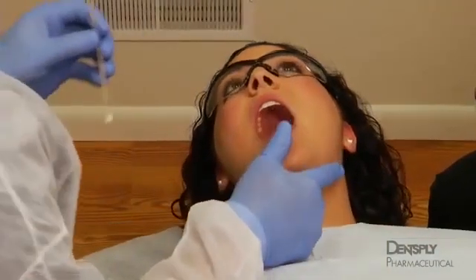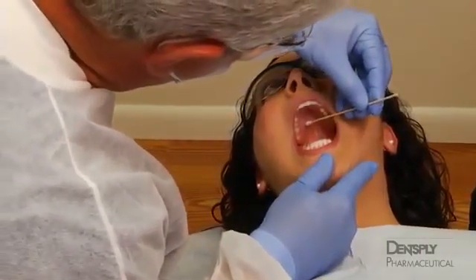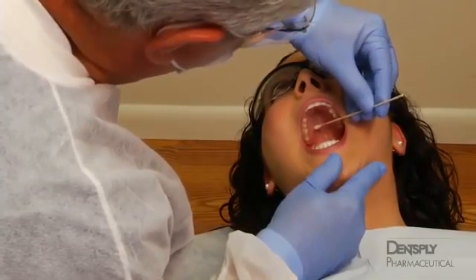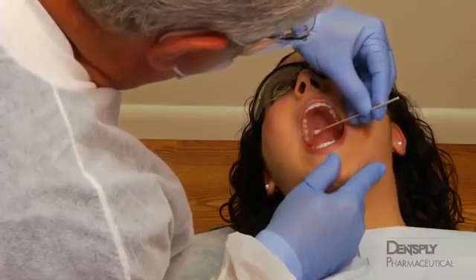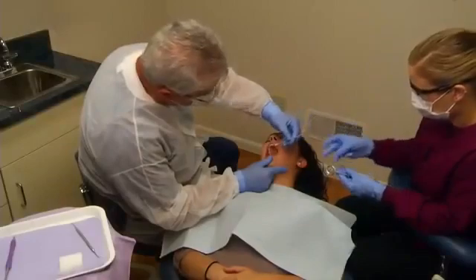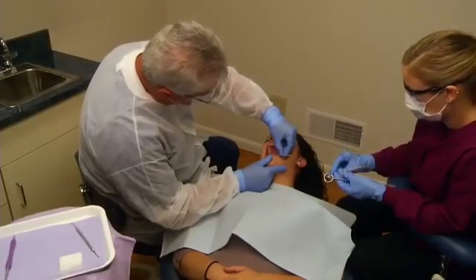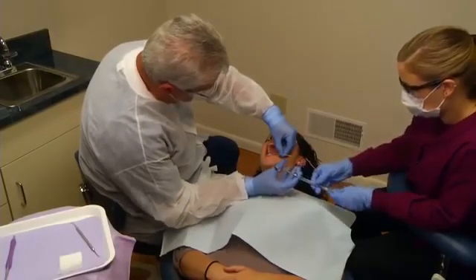Locate the greater palatine foramen by gently sliding a cotton-tipped applicator along the hard palate surface, starting at the junction of the maxillary alveolar process and the posterior hard palate near the maxillary first molar. Move distally until the cotton-tipped applicator falls into a depression, the greater palatine foramen. Using a new cotton-tipped applicator in the non-dominant hand, apply firm pressure directly over the depression to provide surface pressure anesthesia.